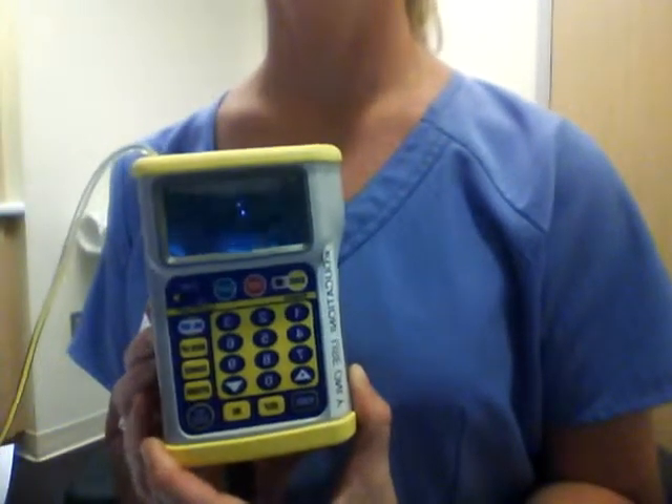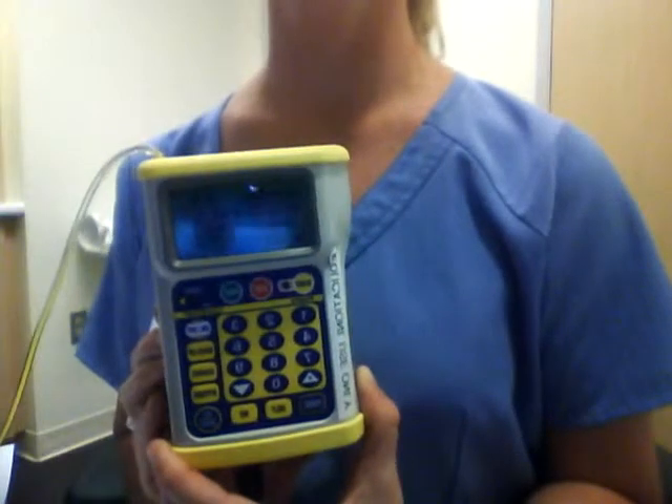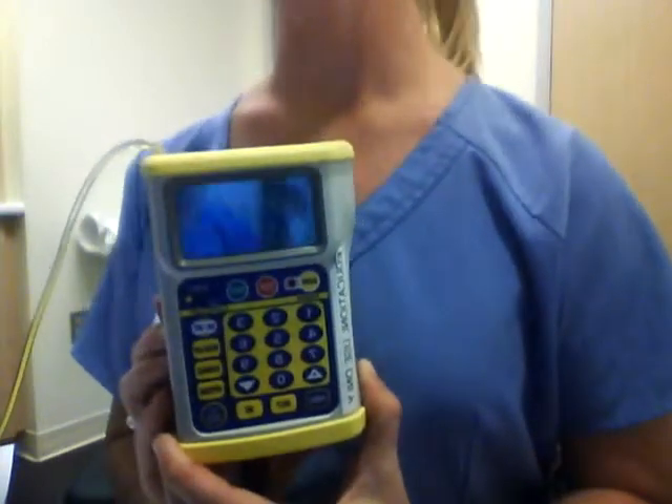Hi, my name is Avery Turber and I'm going to go through some common troubleshooting for the Gemstar epidural infusion pump.